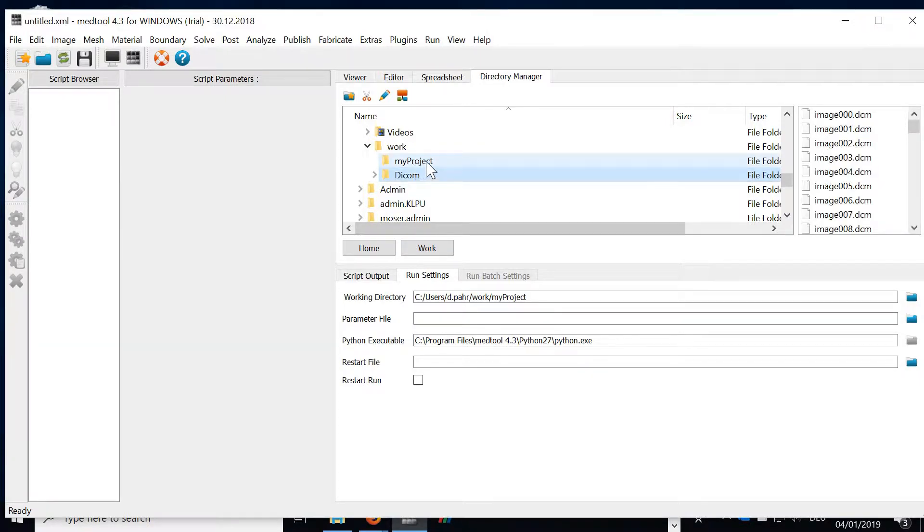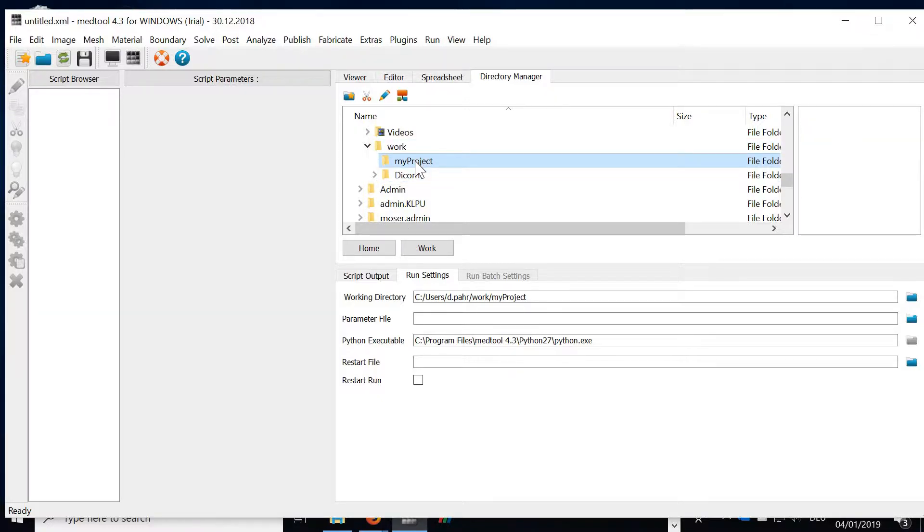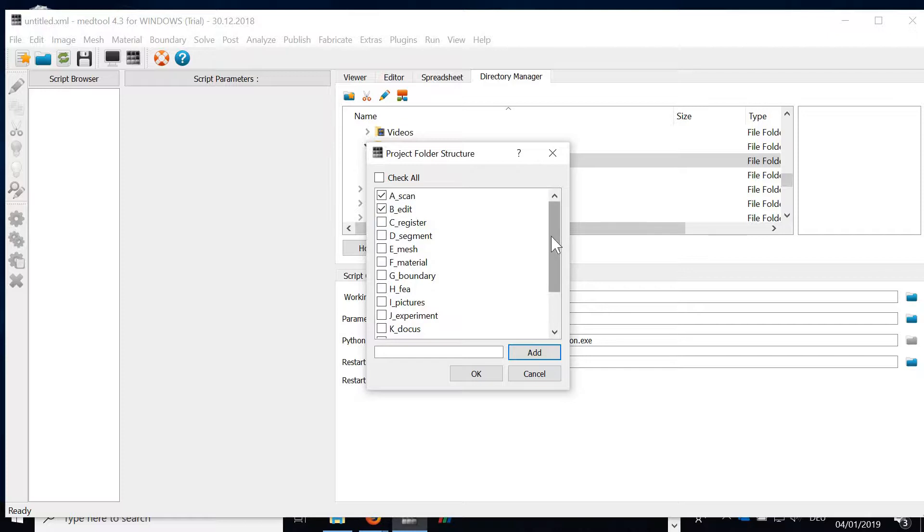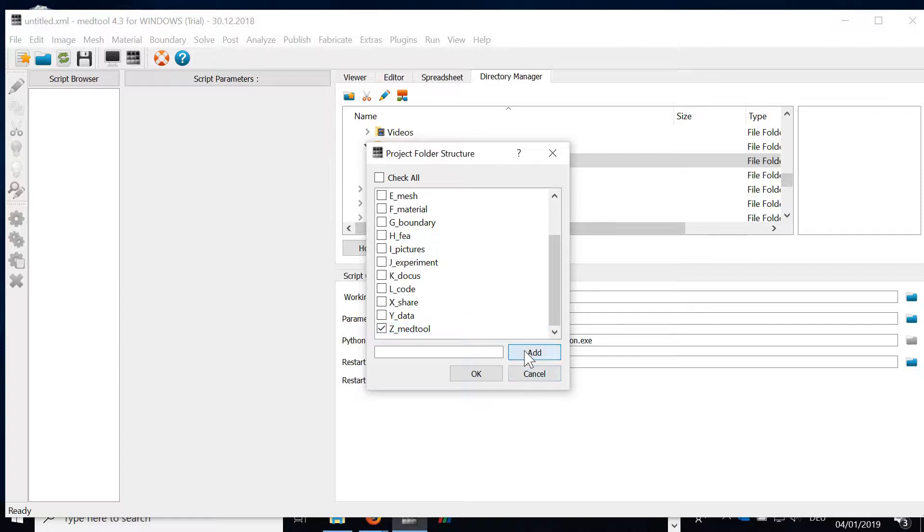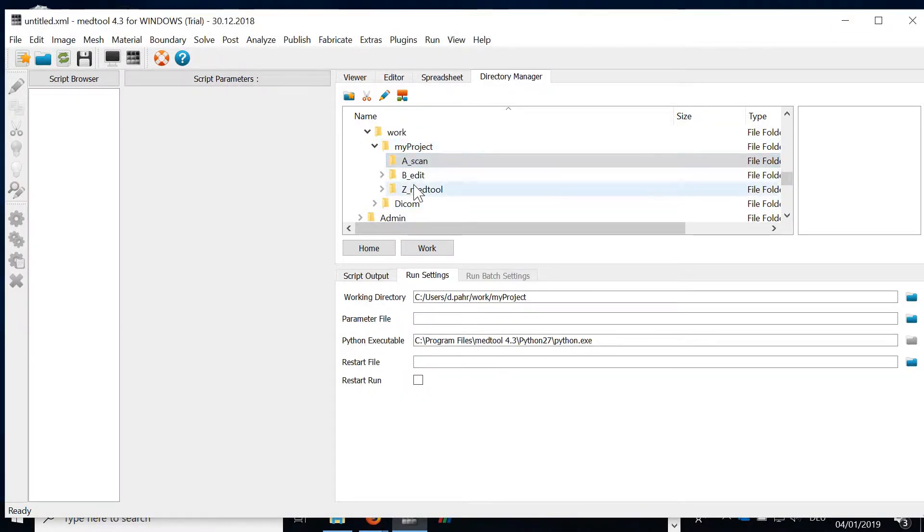The next step we'd like to convert the DICOM images into my projects. What we can do now in this working directory is automatically create a folder structure. By clicking this button here we can automatically generate this project folder structure. In our case we only will have scanned data, we will edit our images, and we will also write out a Medtool database file.